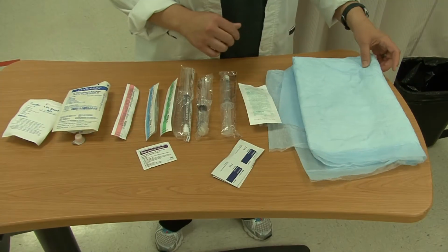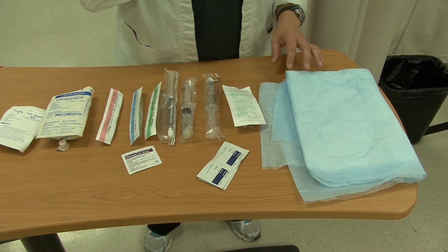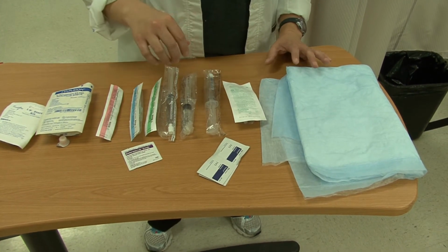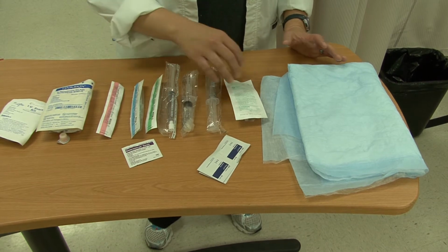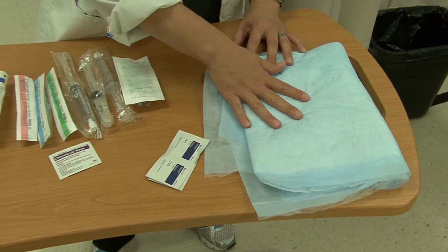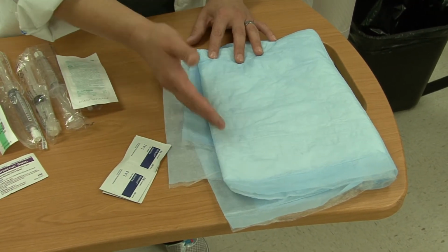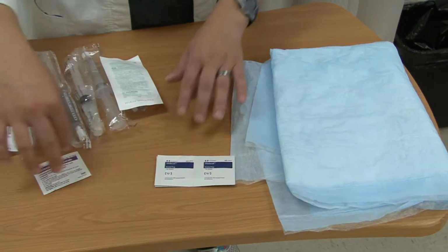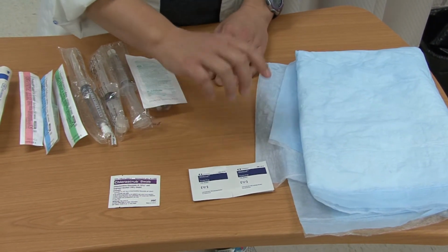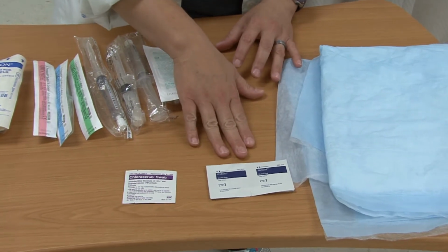So we've talked to Mr. Smith, and we're going to assess his arm in a minute for the appropriateness of the site and the placement, but some equipment you might need to take into the room with you would certainly be a waterproof pad so that you can put underneath the patient's arm, because you might have some seepage of blood whenever you're putting in the IV. You'd certainly want some alcohol to look at the site, because sometimes it helps the veins show up a little bit better.